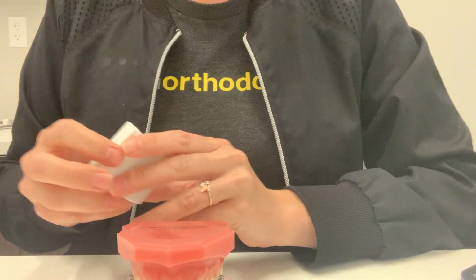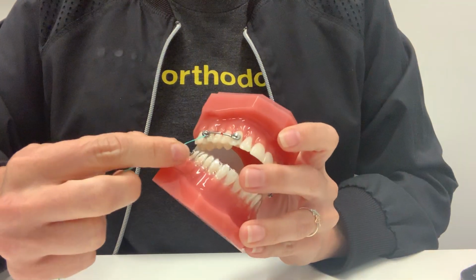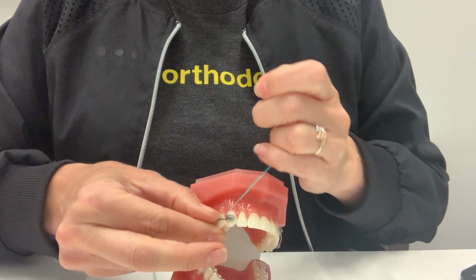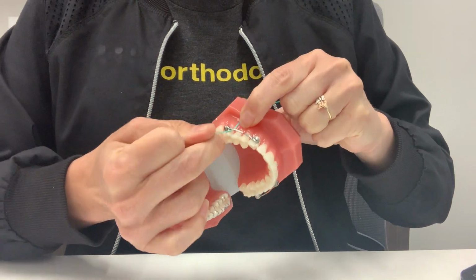To floss with the appliance, you're going to take the floss, go underneath the wire, and then once the floss is underneath the wire, you can floss like normal.